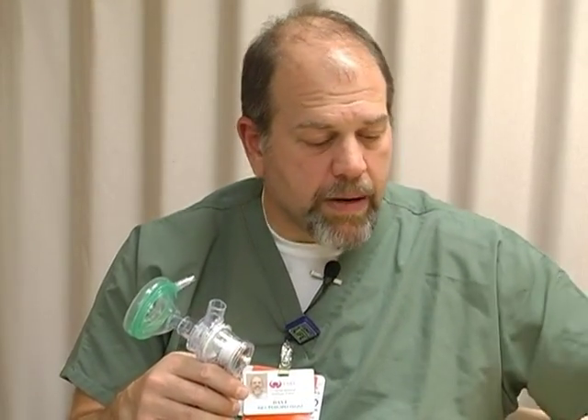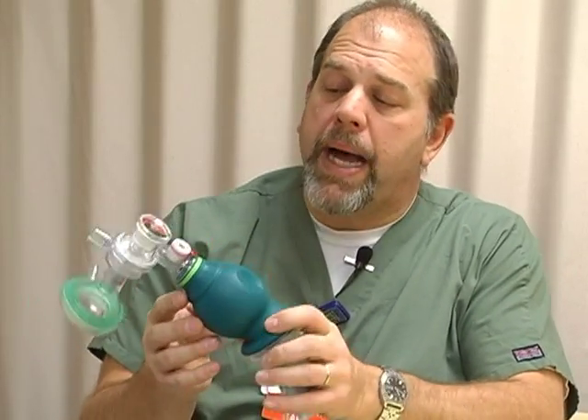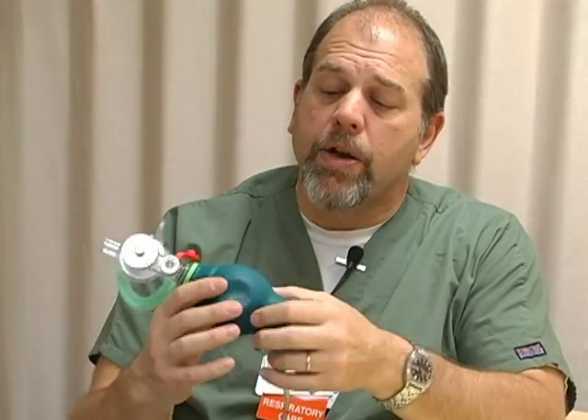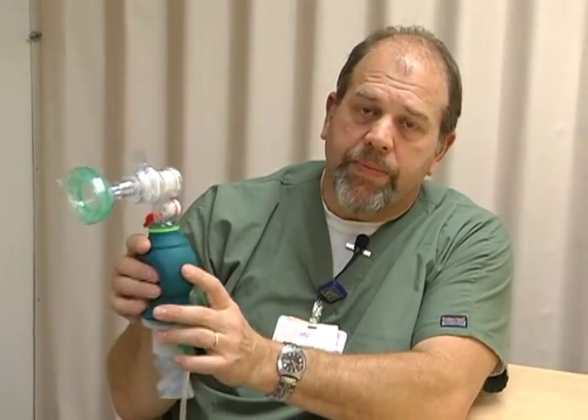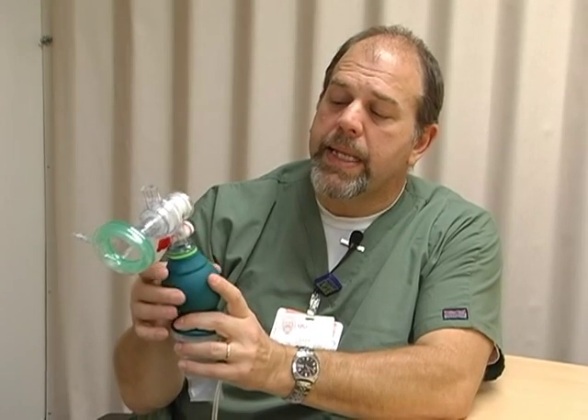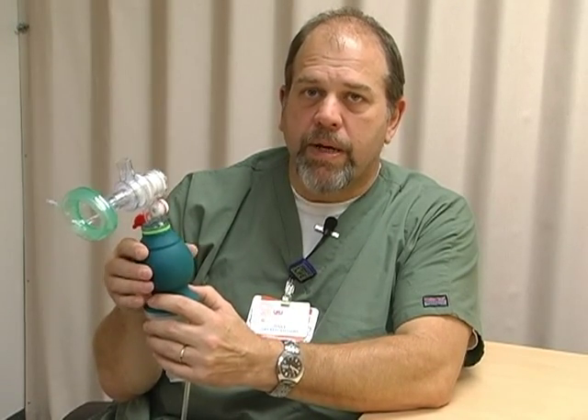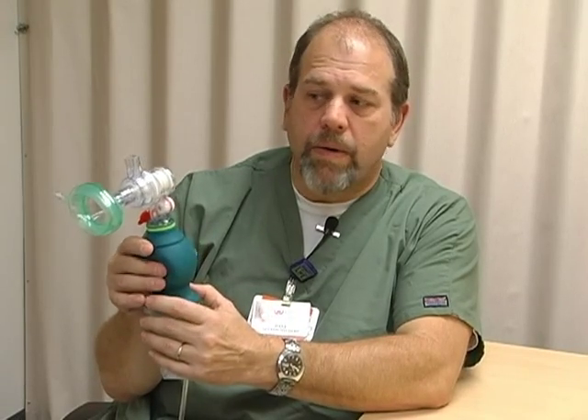The fourth thing: this is called the soft spot resuscitator. As you can see on both sides, there's a place where we hold the bag that is softer than the rest of the bag. This allows us to feel the compliance of the baby's lungs. It's particularly helpful when delivering surfactant or when there's a pressure change in compliance, because we may need to lessen or increase the pressure we're delivering while bagging the baby.